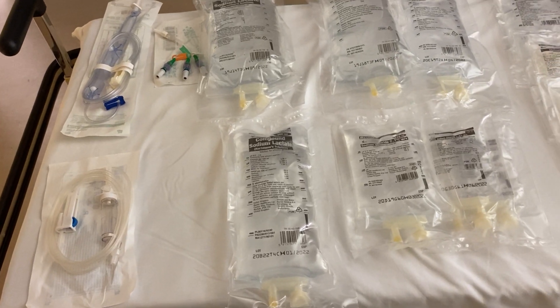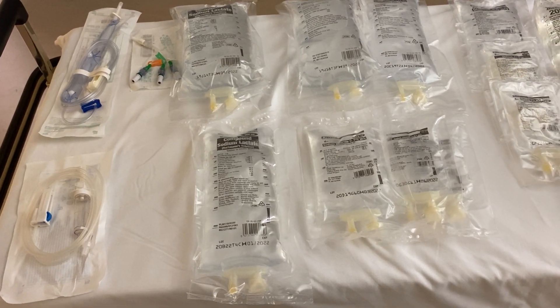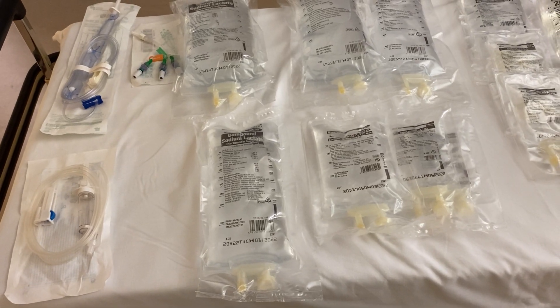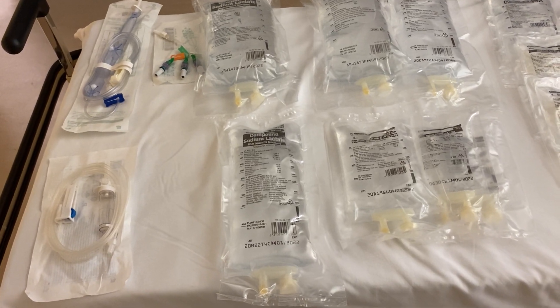Another video here just about intravenous fluids. We'll be having a number of talks throughout the year on intravenous fluids — what to use and when — but I thought I'd give you a little insight as to the types of fluids that we have available in the hospital, and a little bit about the giving sets that we have as well.